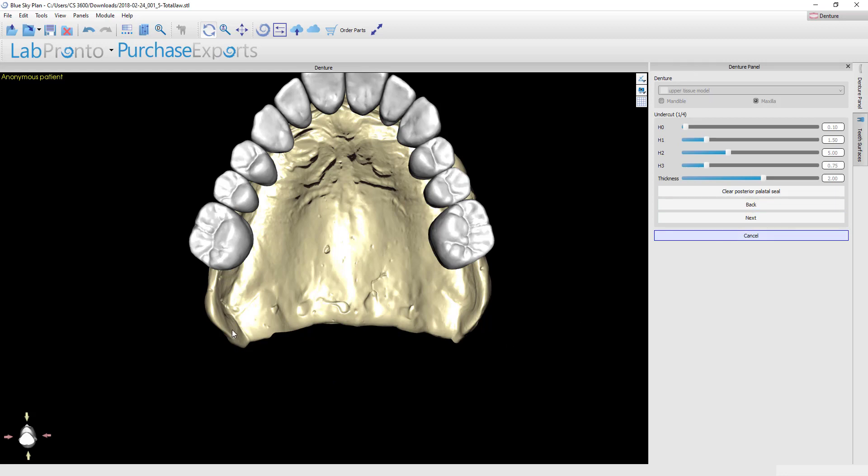Once you hit the palatal seal button, you're going to want to place a dot in each hamular notch. Hold down the shift key and drop a point in this hamular notch, and then hold the shift key and go drop another point in the opposite side. You'll get an initial proposal. You see the cupid's bow shape here.